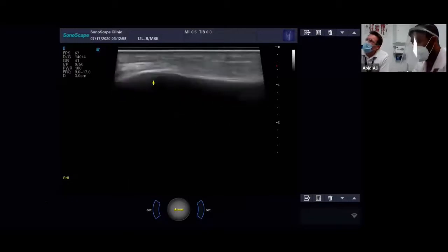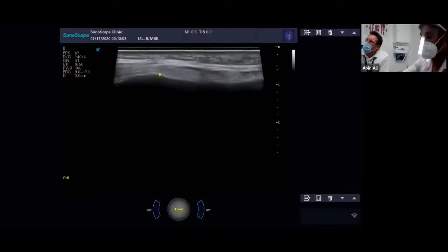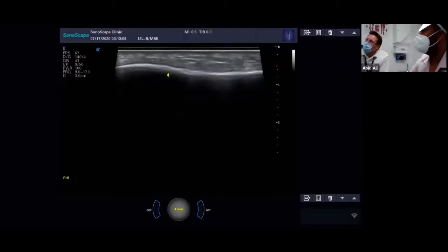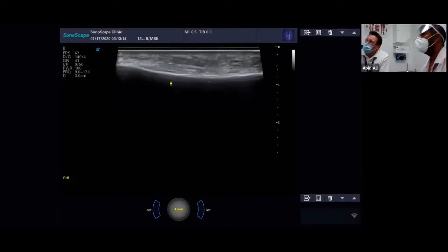Okay, I'm just going to get a bit more jelly because it's going to get sticky there. When you have the bone bright white, that's when you're perpendicular to the bone. So if you go off slightly to the side, you'll see that the bone goes fuzzy, and that means obviously you're not directly over where you want to be. So you want a nice bright bone, and then you know you're 90 degrees to the bone.